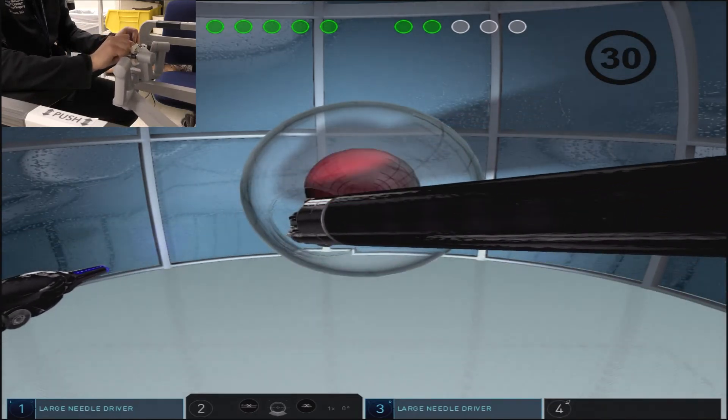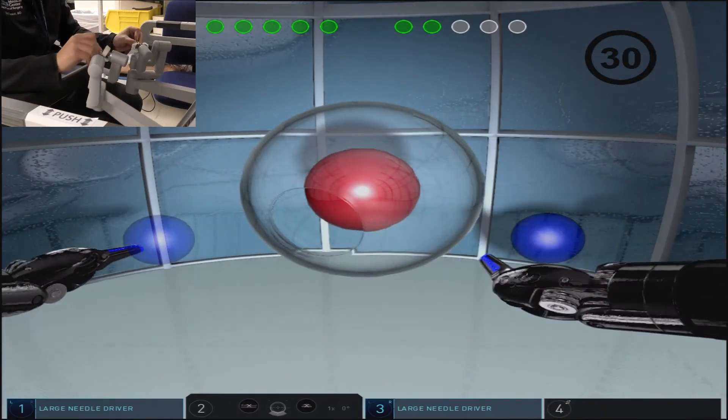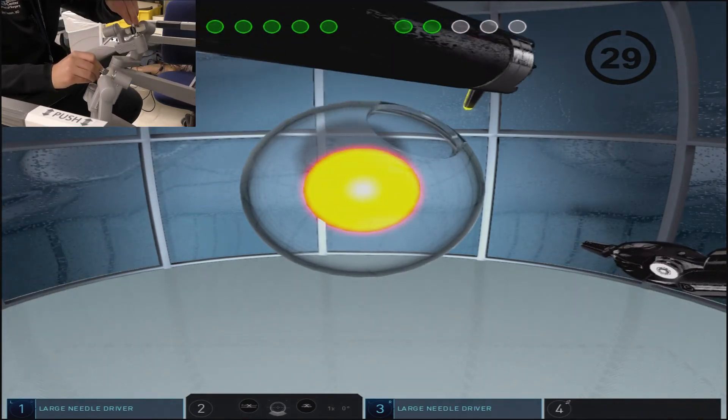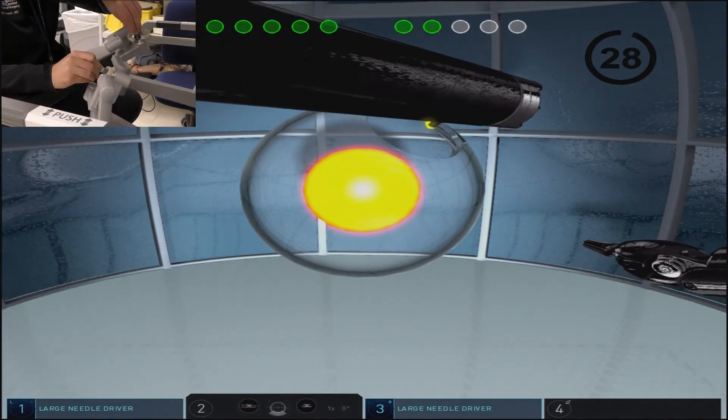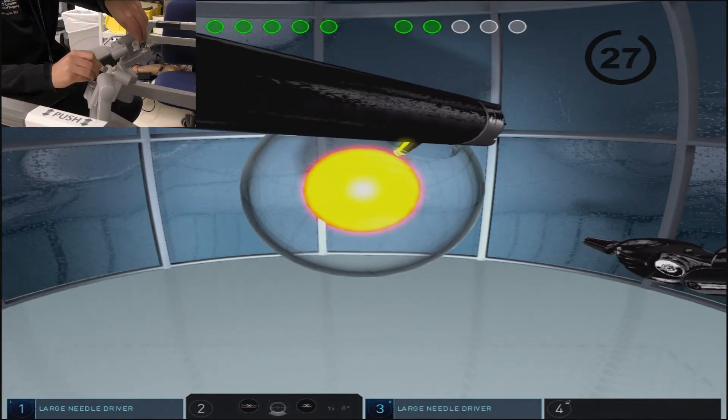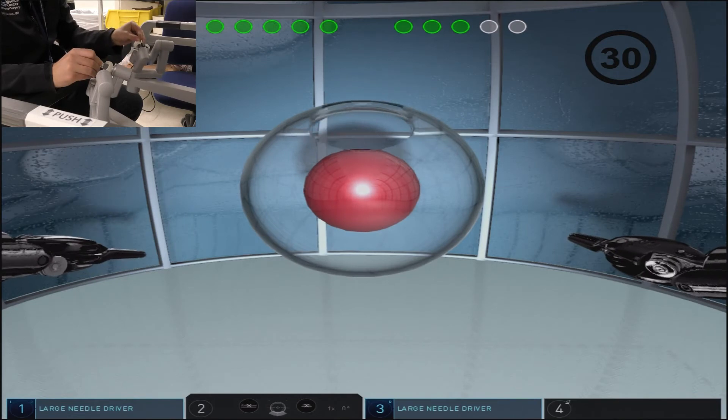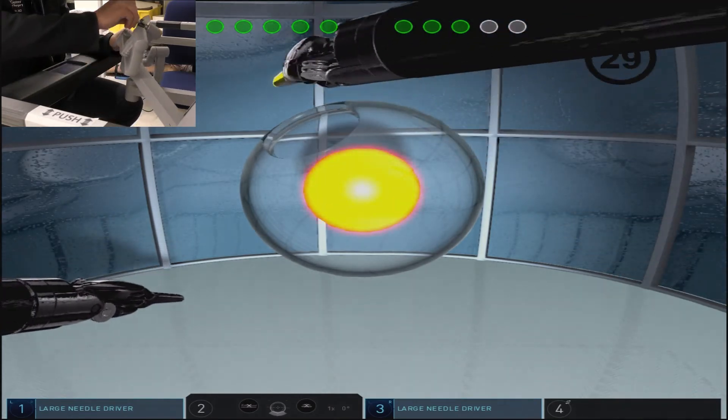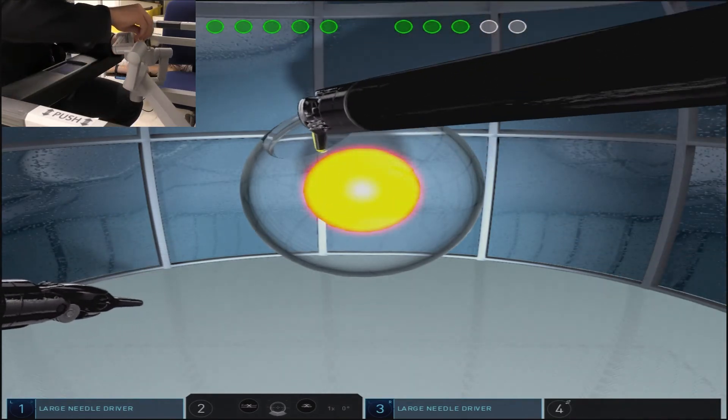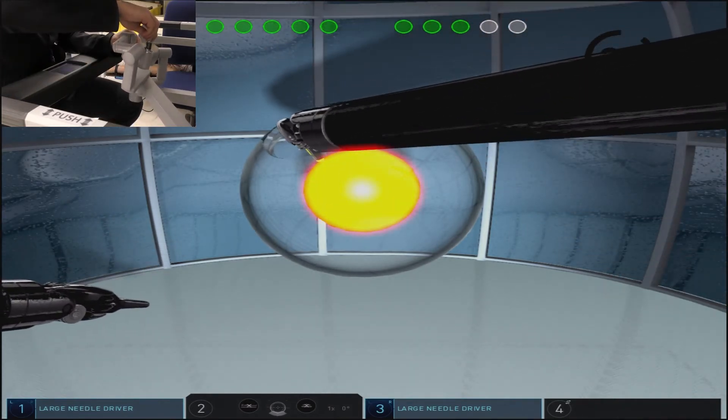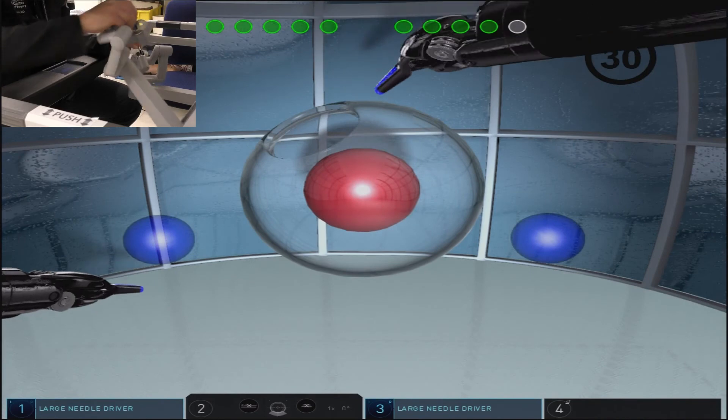Holding the hand controls with the tips of the fingers and at the more distal portion of the controls allows you to maximize the degrees of freedom by which you use the wrist articulation mechanism. You can see that in the left upper portion of the screen.